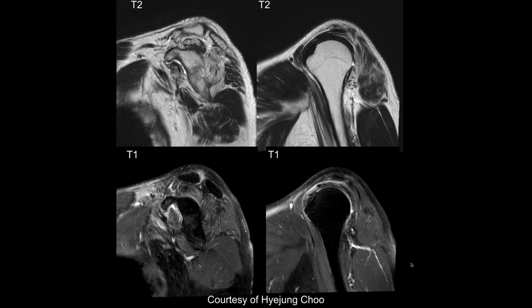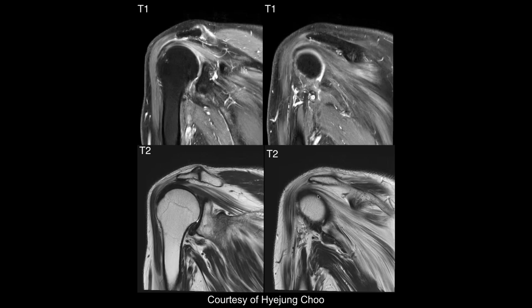I don't know if that's fatty atrophy of the musculature, first of all, in the top left and top right, or if there's some kind of soft tissue process, edema or something going on in there. I'm not sure. So it looks like all the rotator cuff muscles are really abnormal. Yeah. So it's a T2. Well, I mean, just that one picture could be either fatty atrophy or just diffuse edema, I guess. But then it suppresses, so it looks like fatty atrophy. There's a little bit of edema in there, probably. But most of it looks like fat.